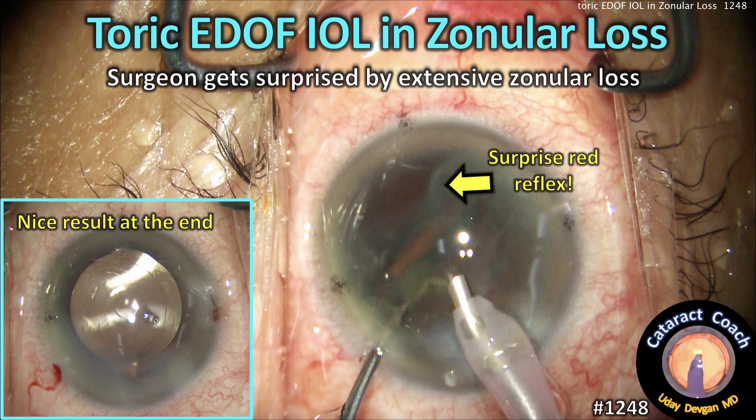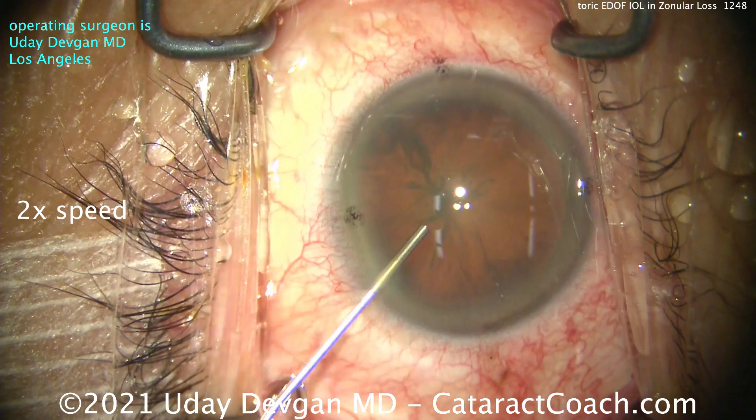CataractCoach.com — a toric EDOF IOL in Zyngler loss. I get surprised by extensive Zyngler loss.